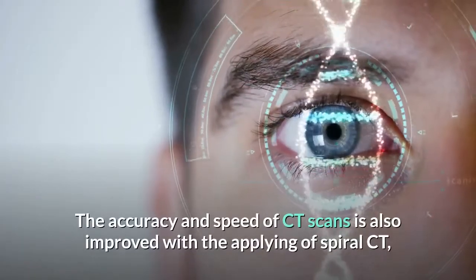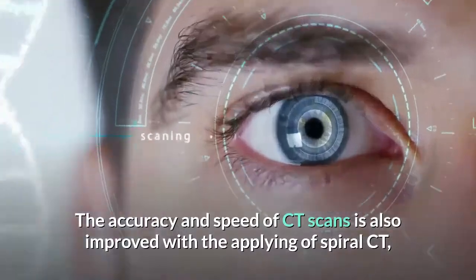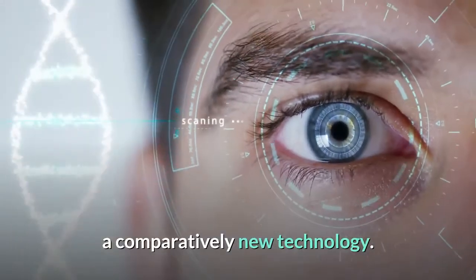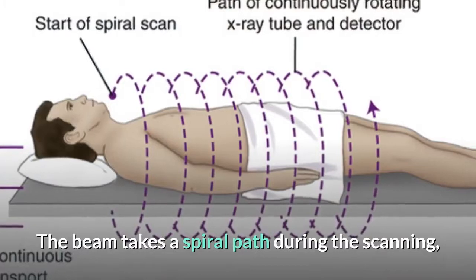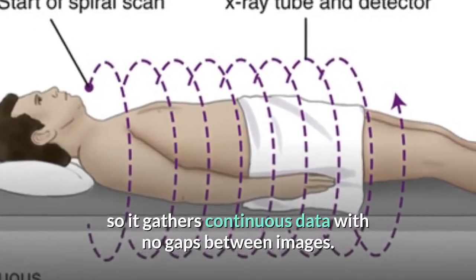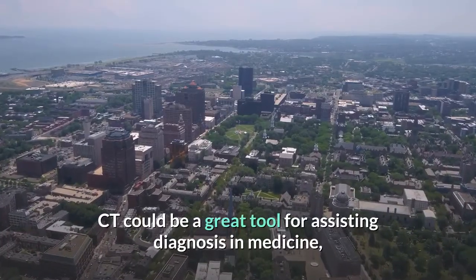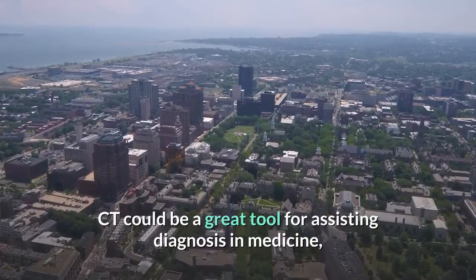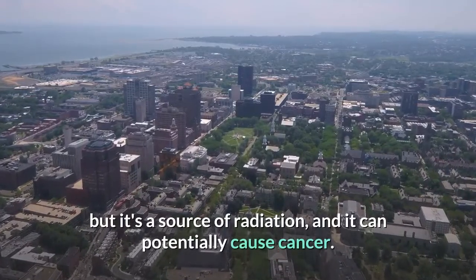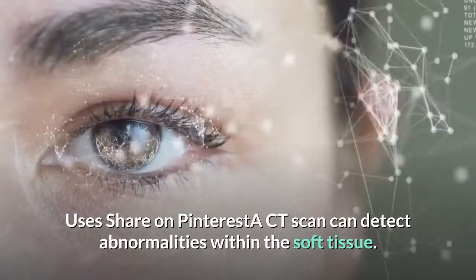The accuracy and speed of CT scans is also improved with the application of spiral CT, a comparatively new technology. The beam takes a spiral path during the scanning, so it gathers continuous data with no gaps between images. CT can be a great tool for assisting diagnosis in medicine, but it's a source of radiation, and it can potentially cause cancer.